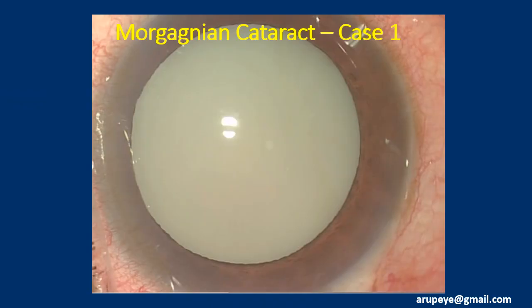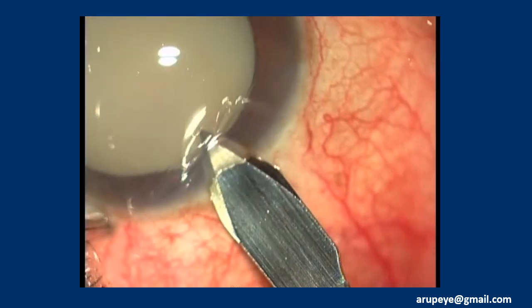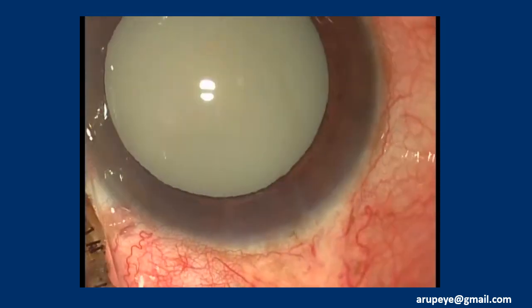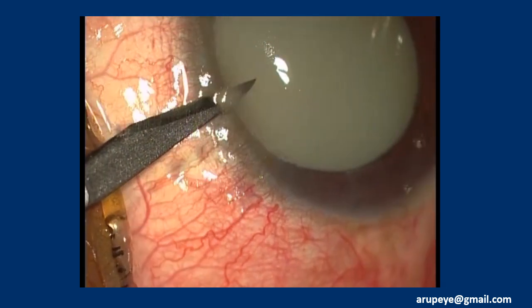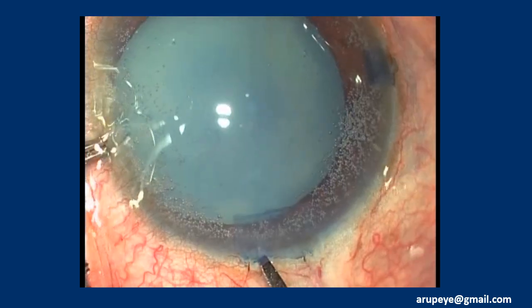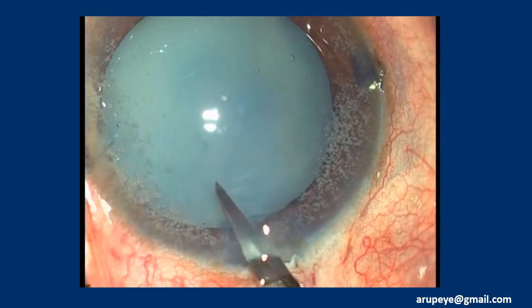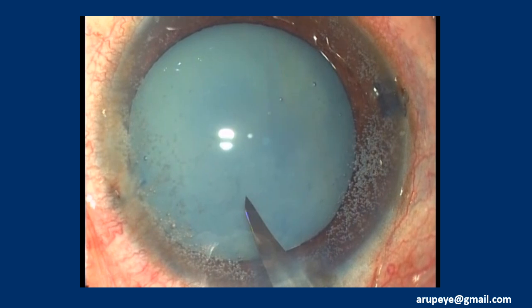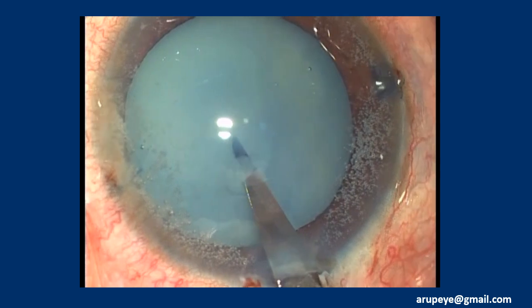This is the first video. Side ports and temporal clear corneal incision are constructed like in any other routine case. The anterior capsule is stained with trypan blue dye. The anterior chamber is pressurized by adequate volume of OVD. The clear corneal incision is opened with McPherson forceps and a linear anterior capsulotomy is fashioned with a 15-degree paracentesis blade itself.